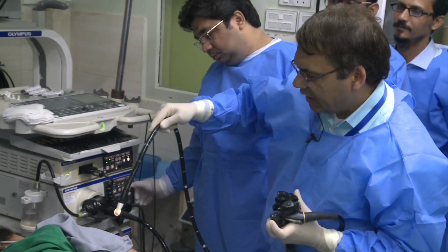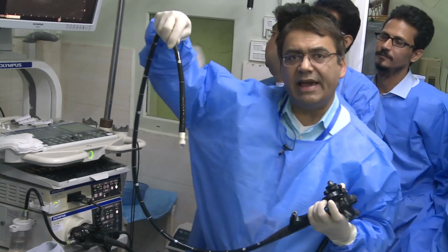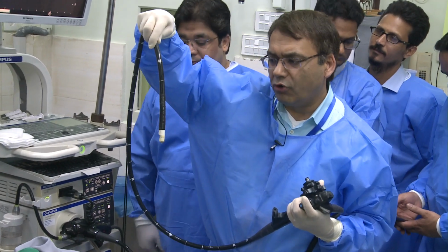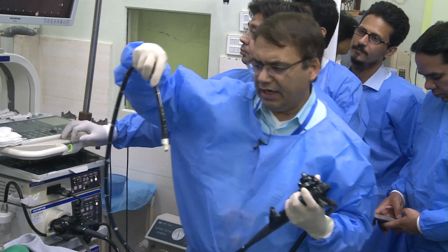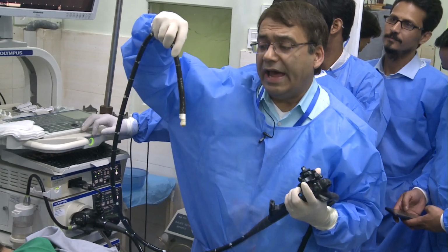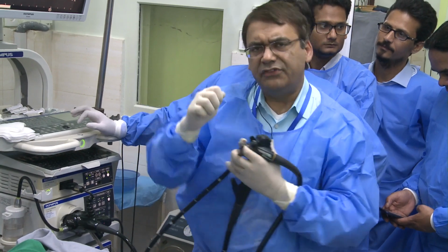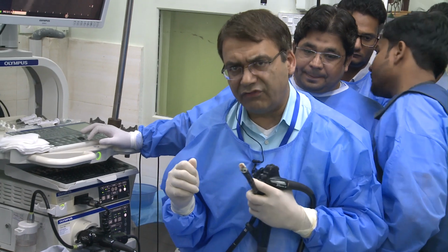here on the scope, if you can take a look, do you have a camera room view, right? We have an excellent room view. We have a very good view. And you can hear me too, right? Absolutely.